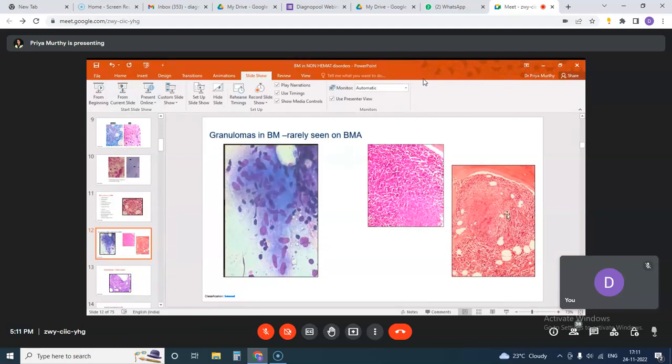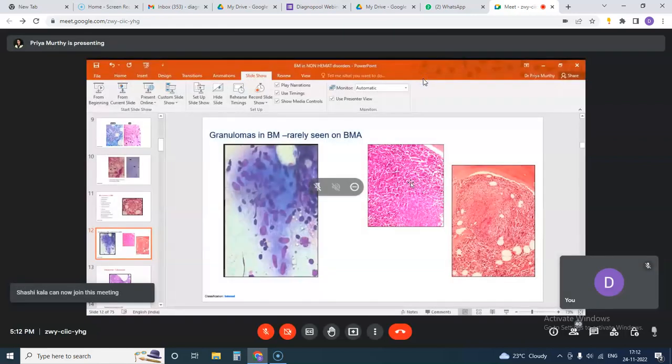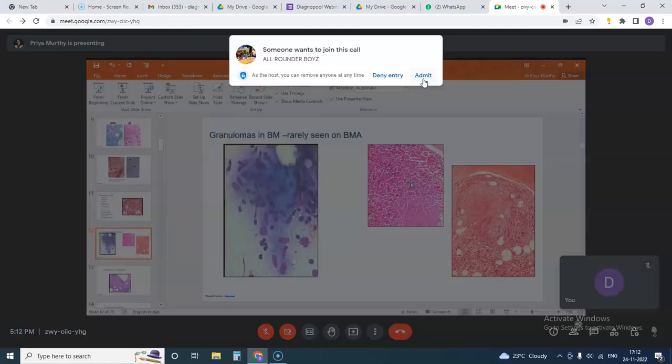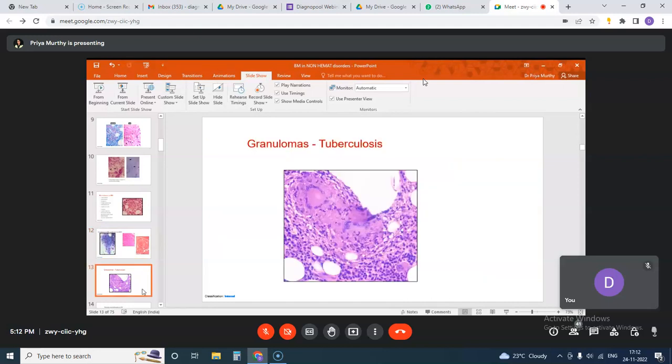In the biopsy, we come across these caseating granulomas sometimes, which are usually paratrabecular in location. There is caseation necrosis. You don't find the typical granulomas that you come across in lymph nodes, where there is central caseation surrounded by epithelioid cells. But in bone marrow, in tuberculosis, these are paratrabecular in location. They are associated with some histiocytic clusters. Then the Langhans giant cells are also present along with it. And an AFB stain turns out to be useful in these conditions.